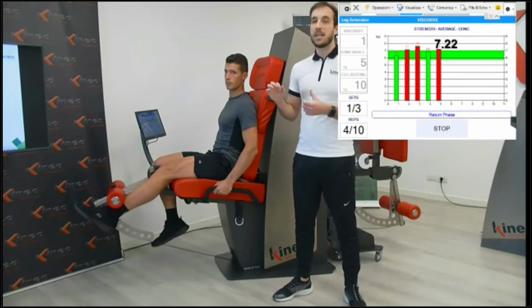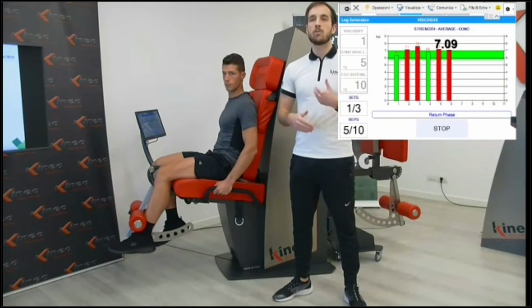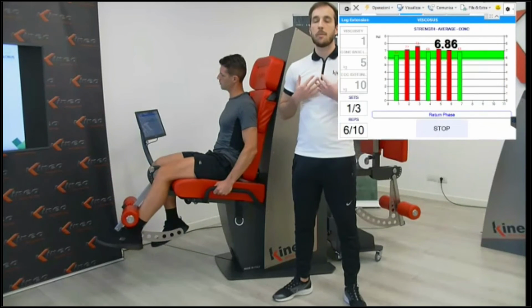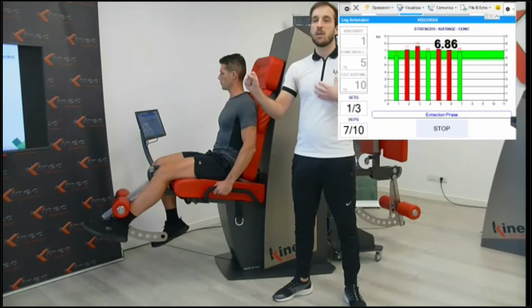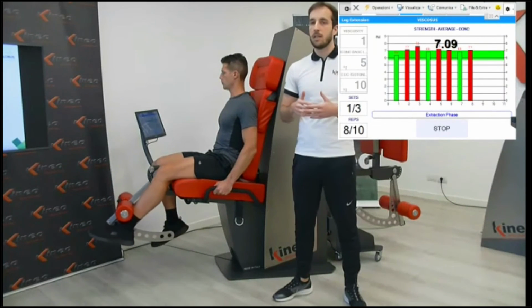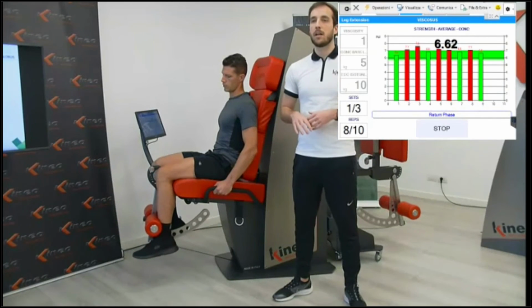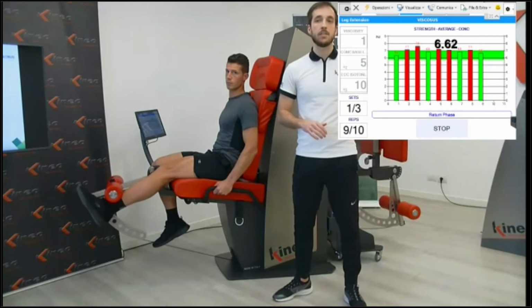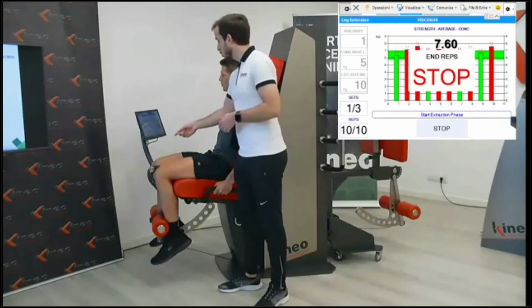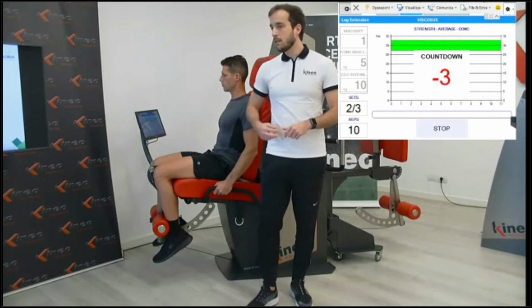So right now, Damiano, imagine that he had some pain, some recovery going on, some rehabilitation going on. He is deciding how many kilograms. I'm not deciding. I'm not putting a fixed load for him on the leg extension, with all the problems that leg extension exercises may have, because this can be done on leg extension, on leg curl, on leg press, on everything.